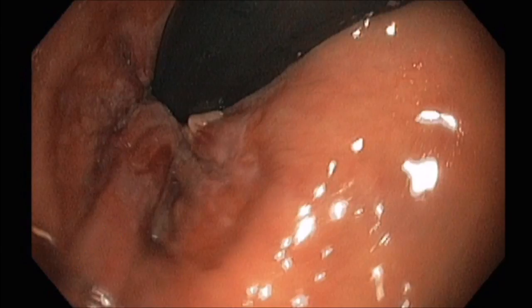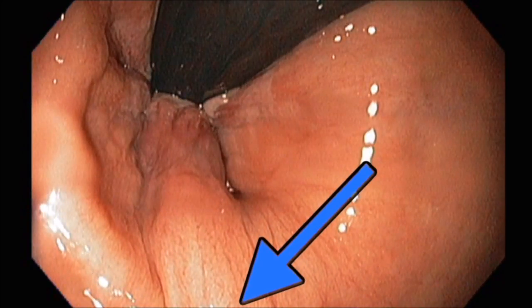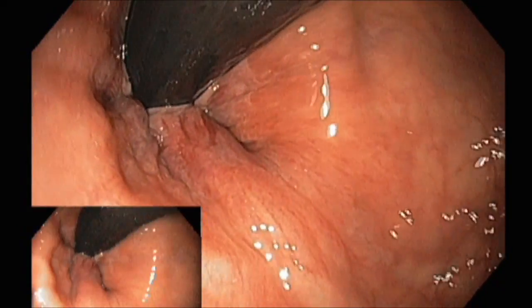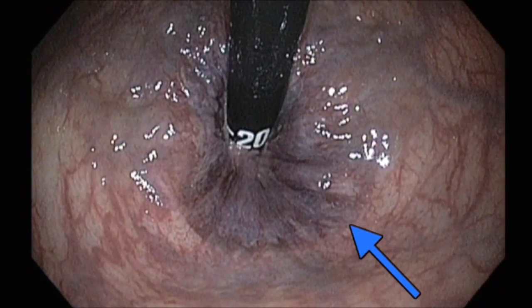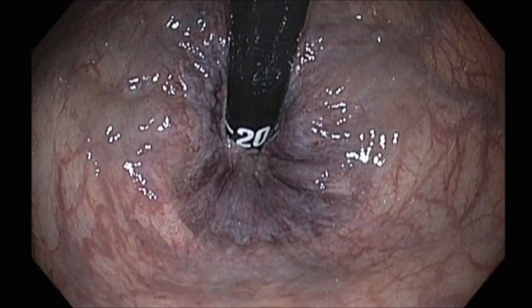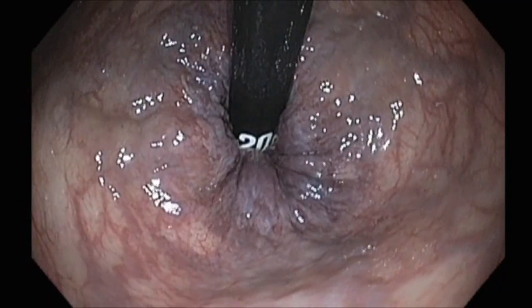You would want to be about two centimeters proximal to that line to band. In this clip you can see the external hemorrhoids, and that arrow is highlighting the dentate line. As you suction air from the rectum, both the external and internal hemorrhoids will become more prominent, as you can see here.